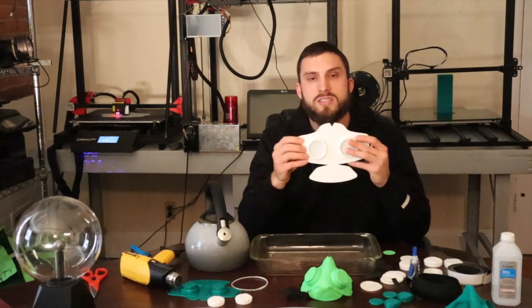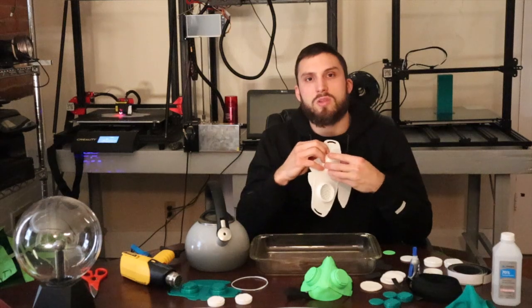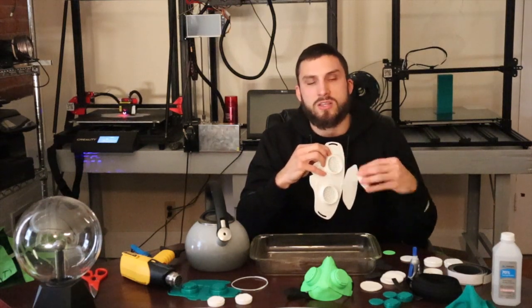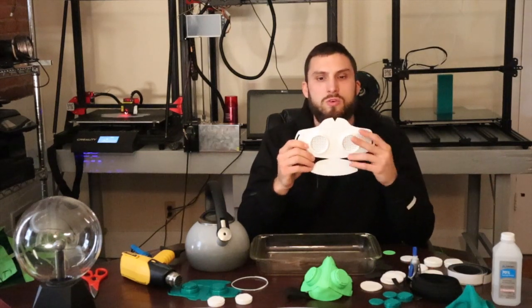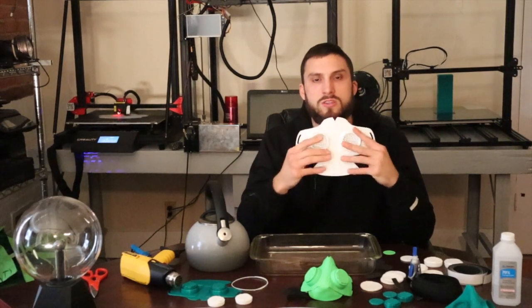Before you dip your mask in the hot water, you're going to want to remove the caps. If you leave the caps in, they will get stuck as the PLA expands from the heat. The next tip is to do this in front of a mirror so you can get an even and symmetric fit as close as possible to your face.